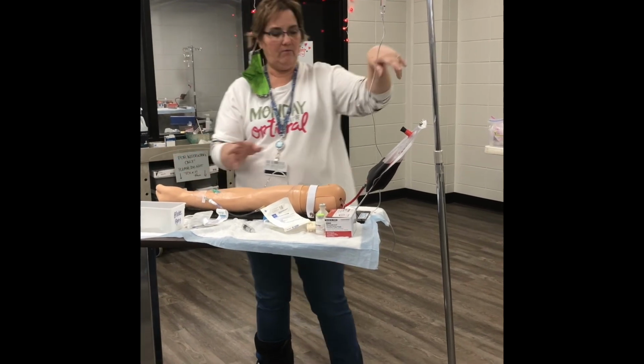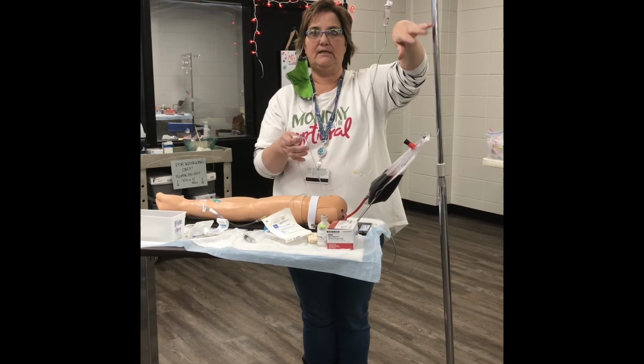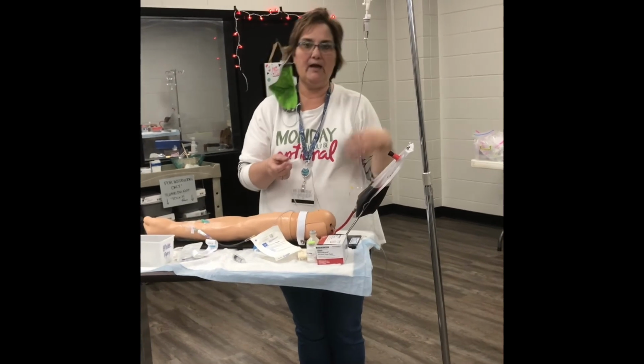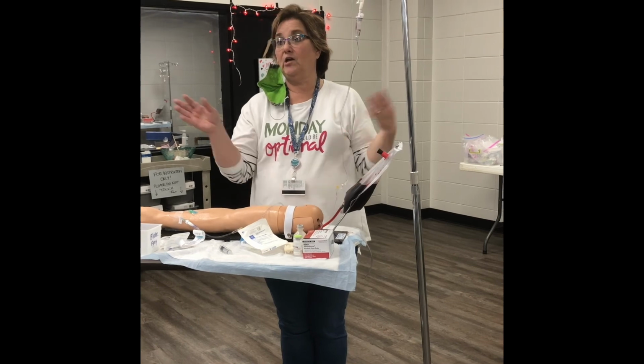So here's how it will work. I'm going to count drops for a minute. Say I get 60. Then I'm going to slow it down and count drops for a minute, and I get 48, and I'm going to slow it down and count drops for a minute, and I get 28, and I'm going to speed it up. Do you see how long that's going to take?